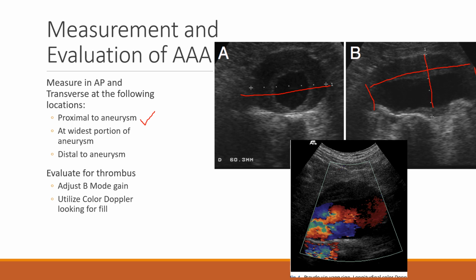The other thing that you want to do is you want to adjust your B mode gain. I know I've talked about this repeatedly in previous lectures, so hopefully I'm not boring you too much, but good practice for your B mode is to take your brightness gain and turn that gain way up as high as you can until it's almost a whiteout, and then taper back off of it until you feel like you've removed all of your artifact and left all your real information.